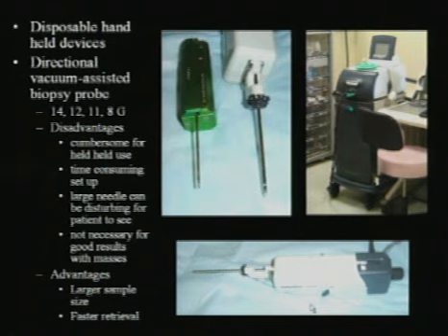With stereotactic biopsy, the patient isn't seeing this. It is not handheld. It is held within the device. And because usually we are biopsying calcifications, it's advantageous to get larger tissue samples. So that's what we use this type of device for.